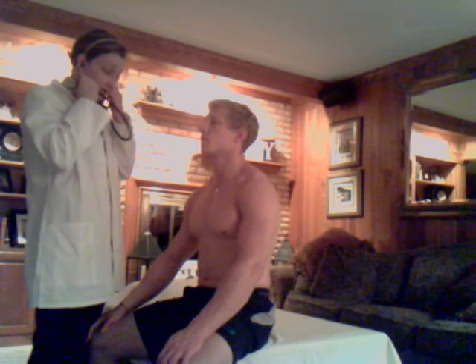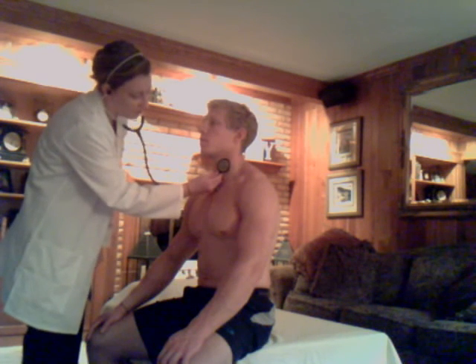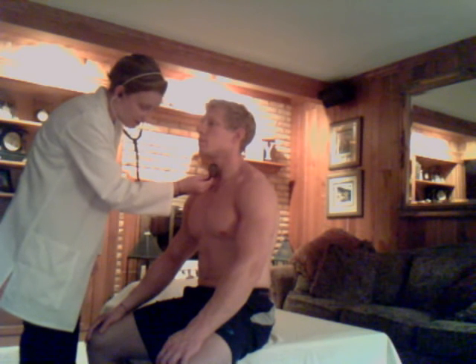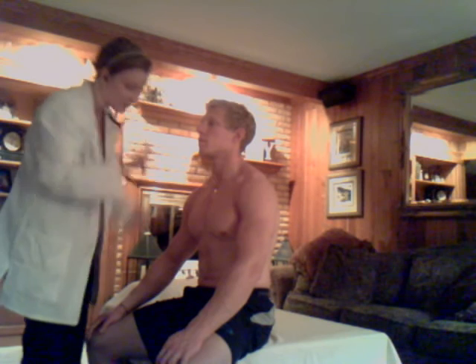Good. Now I will move my stethoscope to the bell and listen for the carotid arteries one at a time. Then have you take a deep breath in and hold it. And breathe. And then another deep breath. And good. Good. I also palpate the carotid arteries one at a time, and they are both 2+ bilaterally.